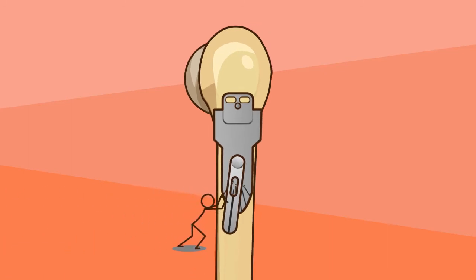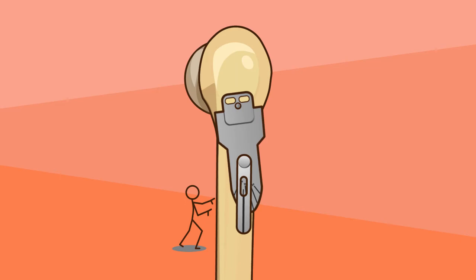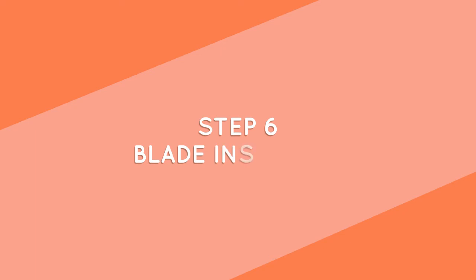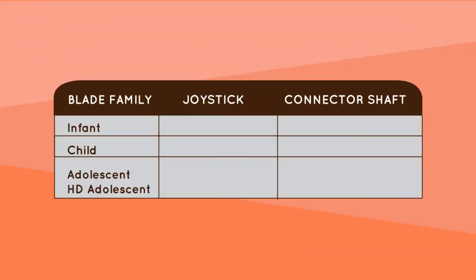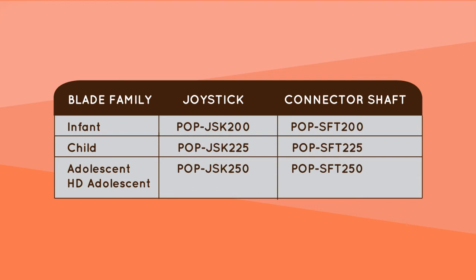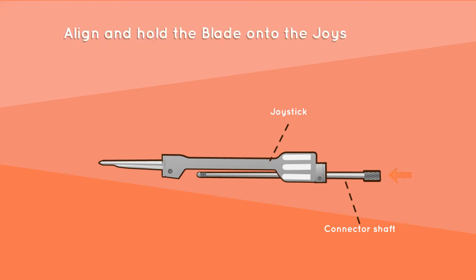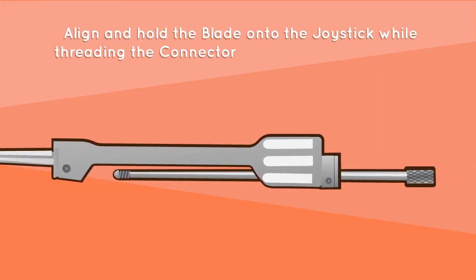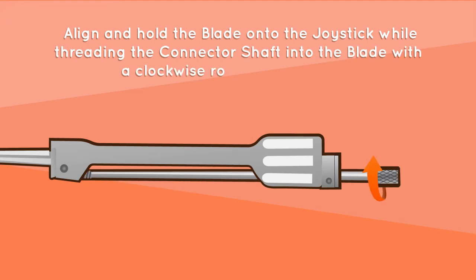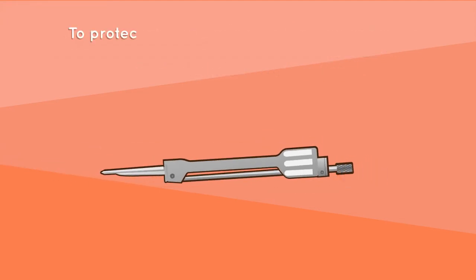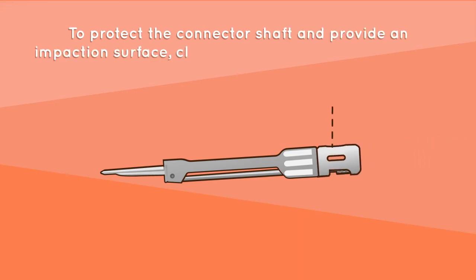Rotate the cortex breaker around the guide wire until the dial of the flexion-extension guide is aligned with the femoral shaft. Step 6: blade insertion. Select the joystick and connector shaft corresponding to the blade family in the table. Slide the corresponding connector shaft through the joystick. Align and hold the blade onto the joystick while threading the connector shaft into the blade with a clockwise rotation of the knob.